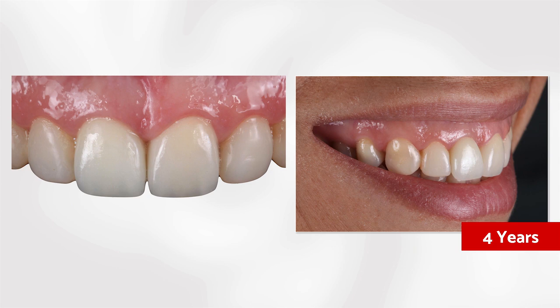If something went wrong since the beginning, we would have some problem because this patient has a high smile line. Imagine if we have here in this case a gingival recession or the papillary loss. It's very difficult to deal with after this problem appears. That's why I recommend you to apply the right protocol to replace tooth, especially in anterior zone. This is why I believe that when we use bone from the tuberosity to fill the gaps, regardless of the thickness of the periodontal biotype, this is the outcome that we are looking for.